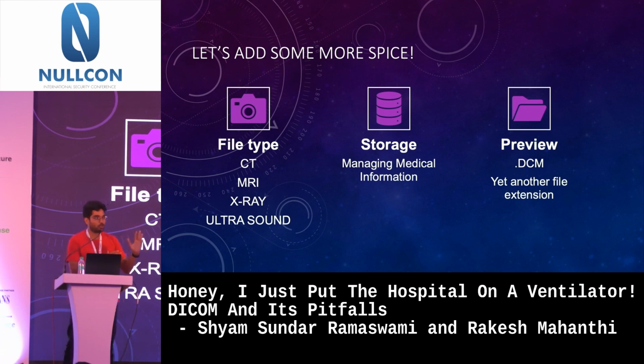So we are going to cover this whole section in 3 things. One being file type, storage, and preview. I'll tell you why. File type can be a CT scan, an MRI scan, or an X-ray scan. Now, if I do that digitally, I have to store it somewhere, correct? And if I have to store it somewhere, I have to move it around.